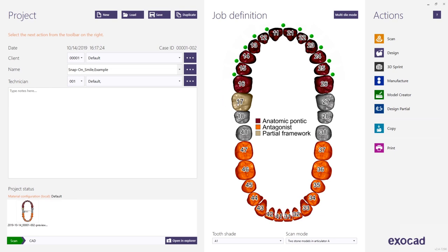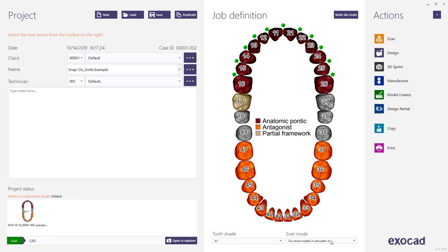For the last tooth I select the partial framework work type, which makes it easier for the software to understand what's going on. I also activate the virtual articulator in this case. Now I can go directly to the design.